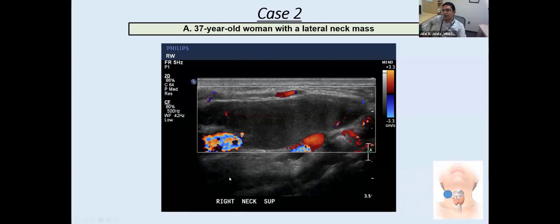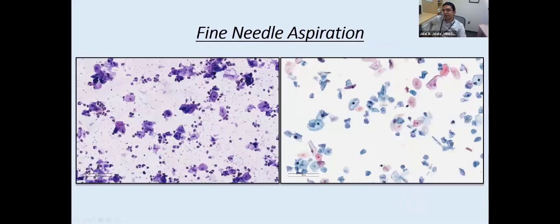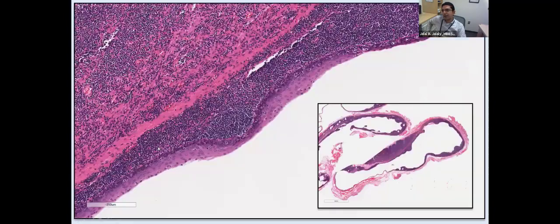So let's look at the FNA that was performed on this case. As opposed to the first case, you can see here that these squamous cells in the Diff-Quik and Pap stain are still maintaining a low NC ratio. Their nuclei are quite round with smooth nuclear membranes. And you can see here that even though in the Diff-Quik there's a background debris, and in the Pap there's some degeneration, there's not much necrosis going on in the background. So overall, features of a benign squamous lined cyst.